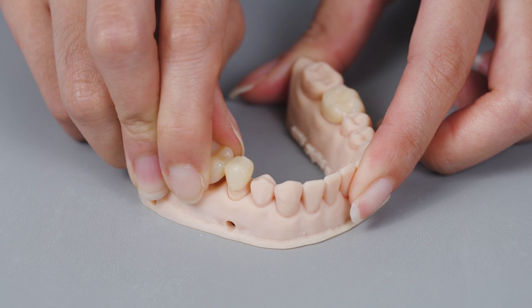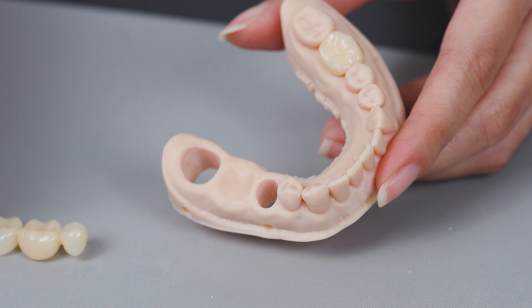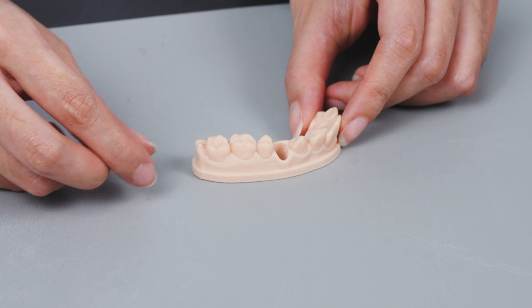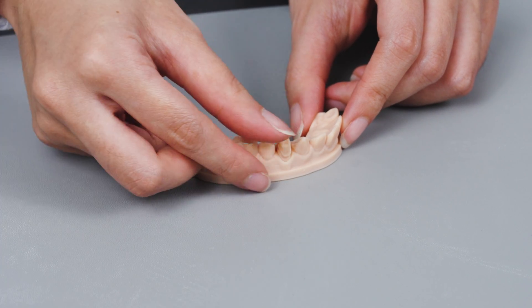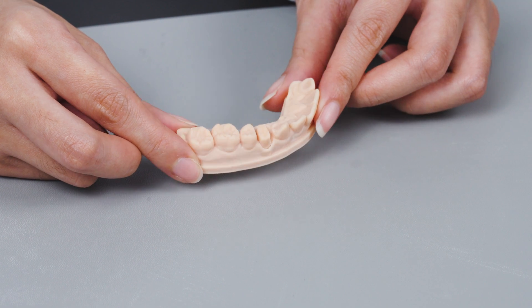Today, we're going to show you how to 3D print a crown and bridge model with a removable die. For this indication, it is crucial that the dies fit precisely with the model base. We will use Frozen Dental Solution to ensure this precise accuracy.